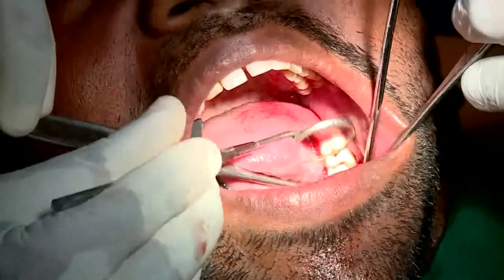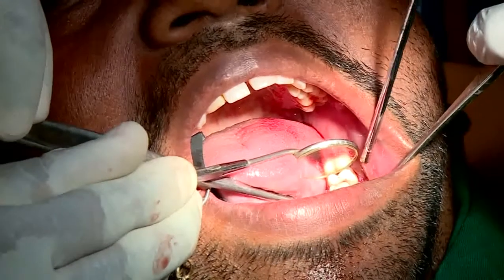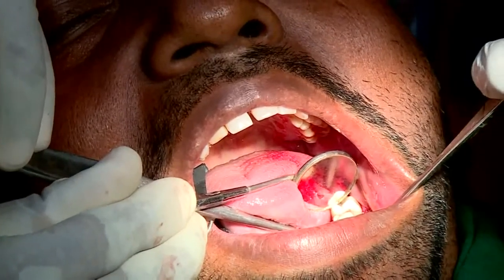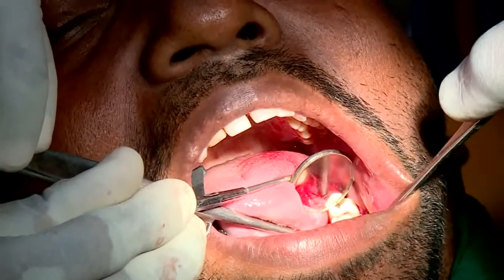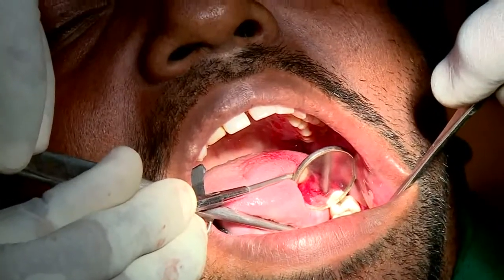Dr. Yasser, through this mirror, by any chance, can they see the osteotomy site? Of course, because this is hidden, even for our own vision. Yes, you can see the osteotomy site. As you can see, it is now positioned in between the premolar and the molar. And between buccal and lingual, we have shared it equally.